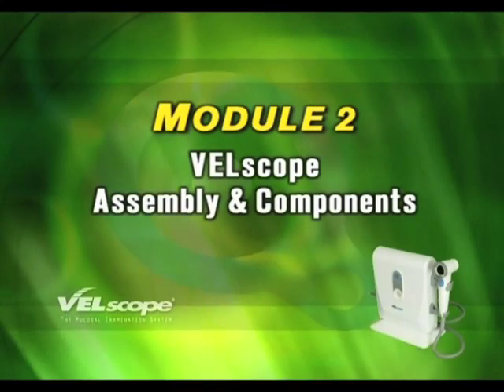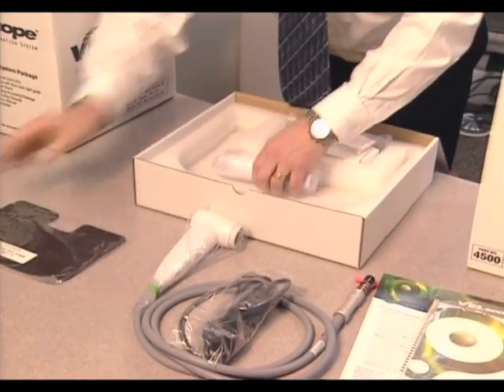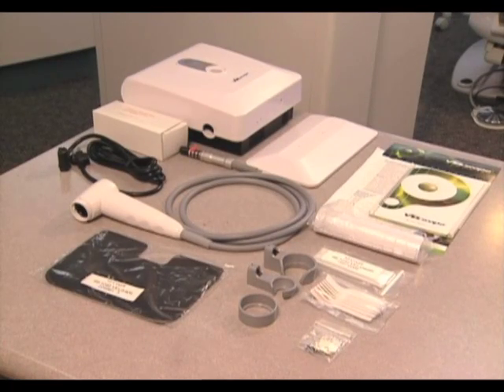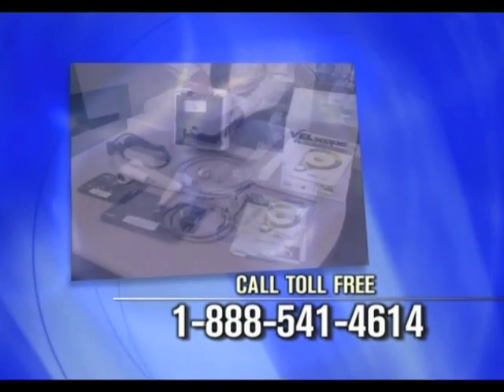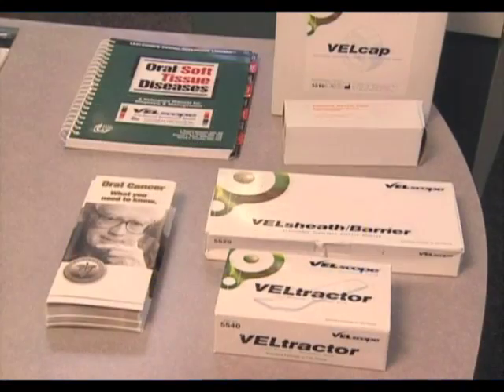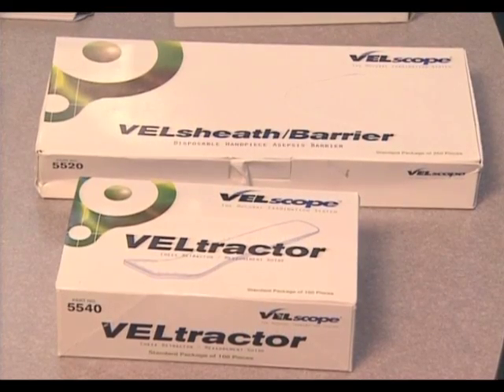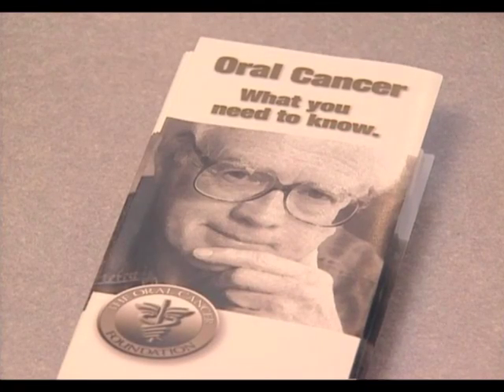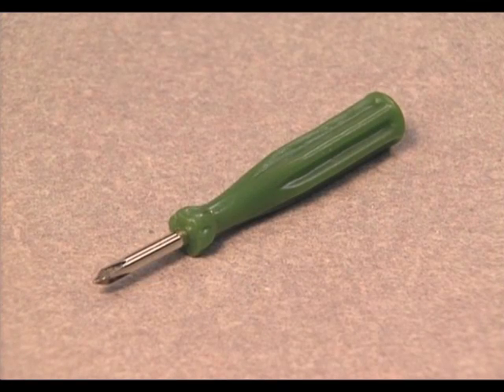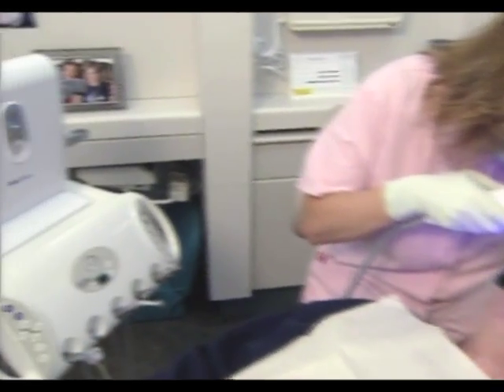Module 2 – Velscope Assembly and Components. Thoroughly inspect all system components as you unpack the Velscope system. If you notice any damaged or missing parts, contact customer support immediately, having your dealer information available along with your unit serial number, which is at the back of the system. A Phillips screwdriver is required to assemble the Velscope system. The Velscope LSU is designed for use in either a vertical or horizontal position. Decide on the best configuration for your operatory before assembling the system.